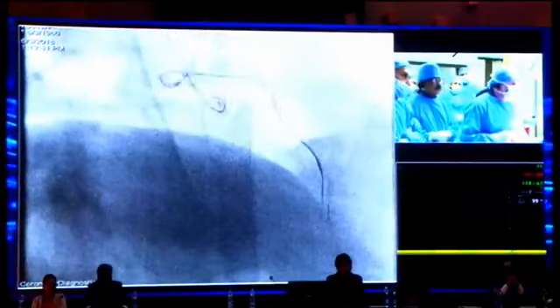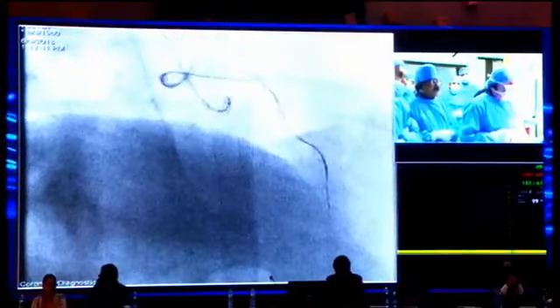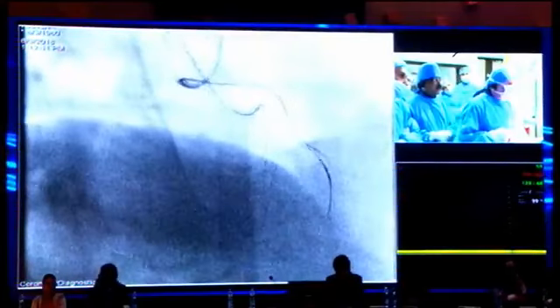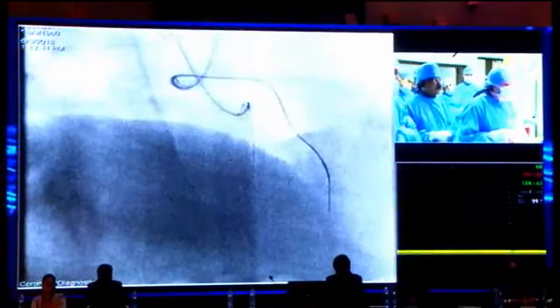Yeah. Your wire will actually go up, if it's correct. Yeah.